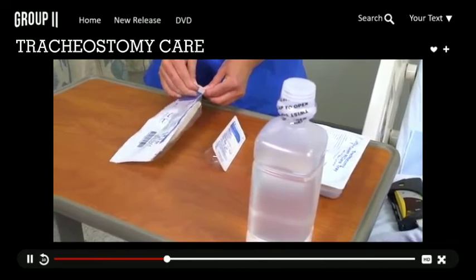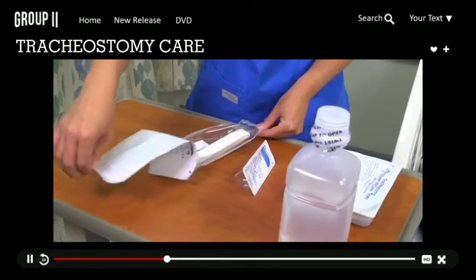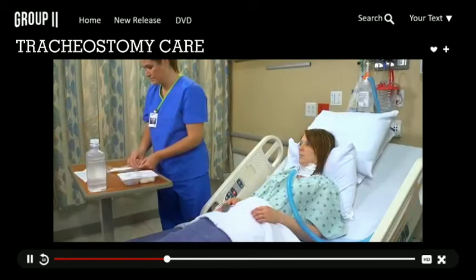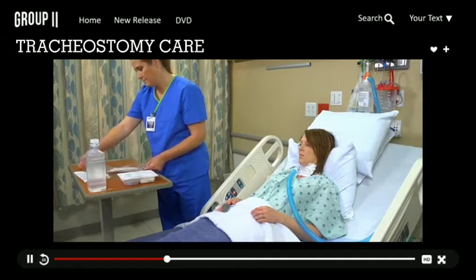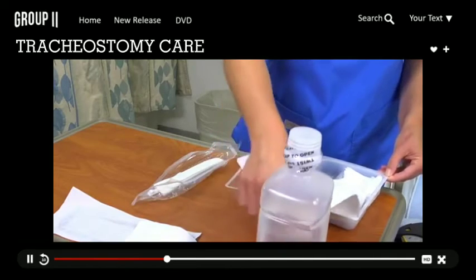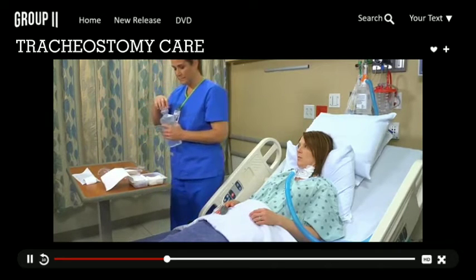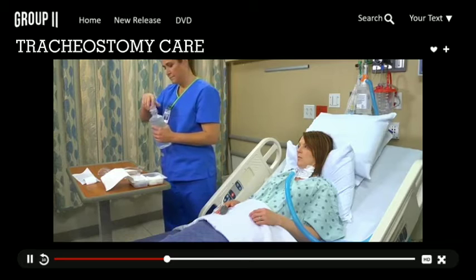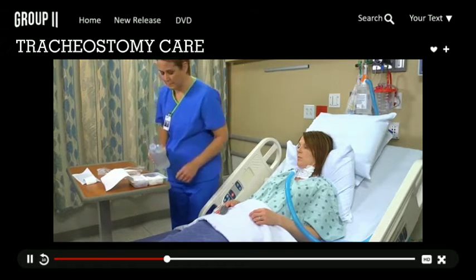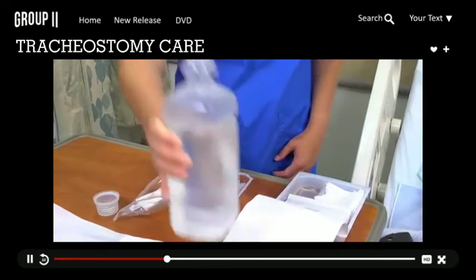Open the package for the tracheostomy tube holder according to the manufacturer's instructions. If your patient has a disposable inner cannula, open that package now. Then open a tracheostomy care kit, which contains 4x4 gauze, cotton-tipped applicators, dressing, cleansing brush, drape, and a suction catheter. Pour 1/2 inch to 1 inch of normal saline solution into the sterile basin. Don't recap the bottle of saline.